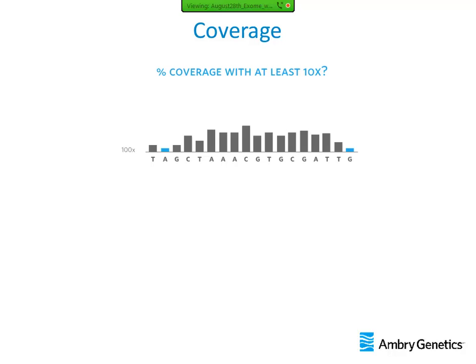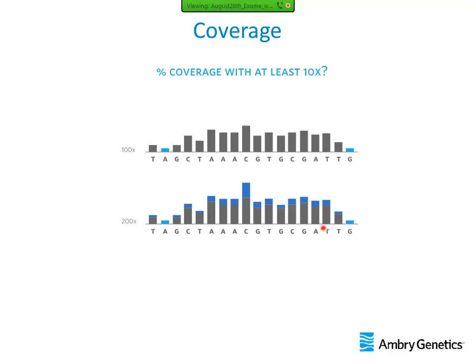So when we add probes to improve base pair coverage, we may be able to improve the average base pair reads. So, for example, if we get a base pair average read of 200, the probes that we're adding really just stick to those nucleotides that already have the base pair coverage. So the percent that we're seeing with less than 10 base pair reads is still the same, regardless of whether there's an average of 100 base pair reads or 200 base pair reads.